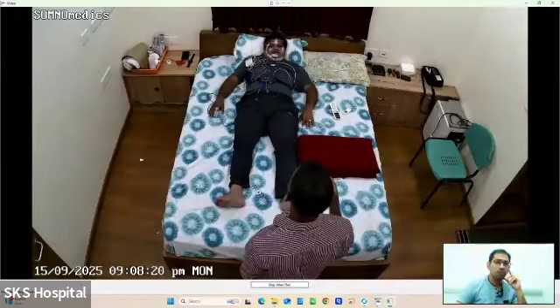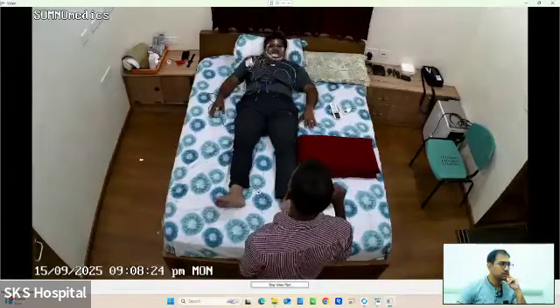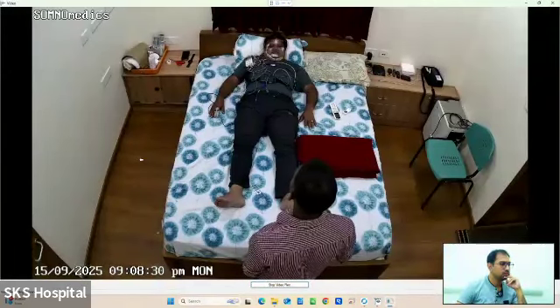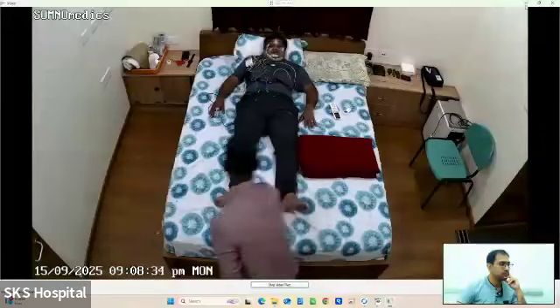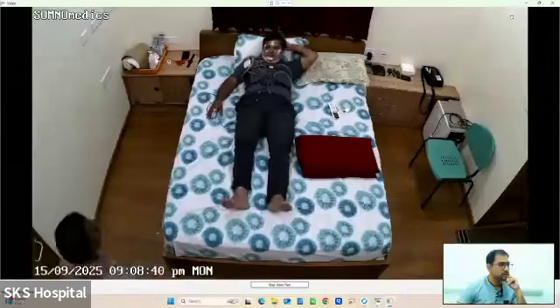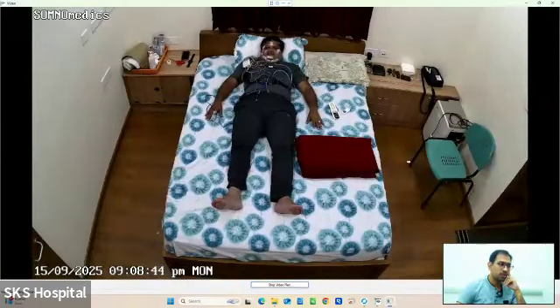Now we need to do an important thing which is called biocalibration. So the patient has to be given the instruction.